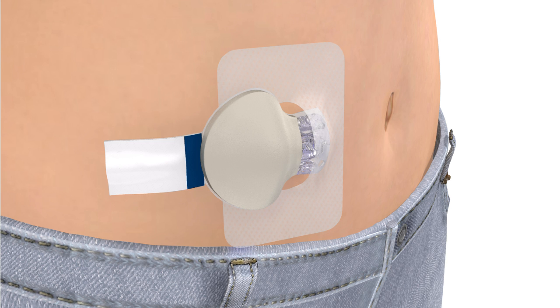If necessary, use a mirror to see the green light. If the light on the transmitter does not flash, disconnect the transmitter from the sensor and place it back on the charger until it is fully charged. Then reconnect the transmitter to the sensor.